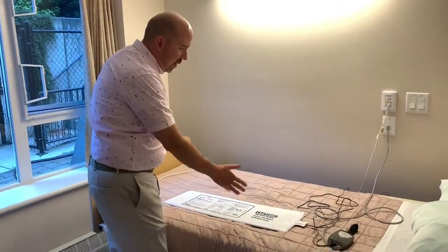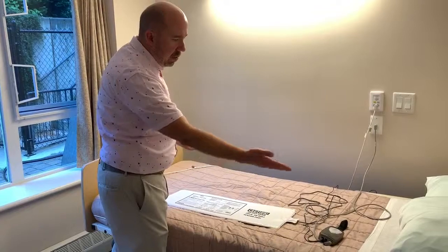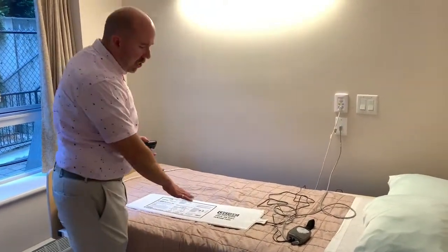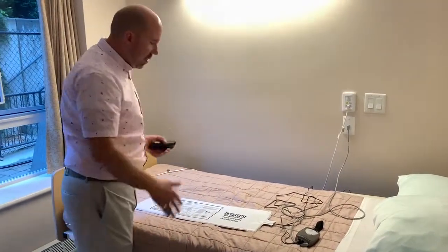So this pad, we just have it on the surface for demo use, but usually you'll put it under the sheet so the resident can lay on. They don't have to lay directly on it. So you can have this under the initial bed sheet on the mattress, like on top of the mattress.